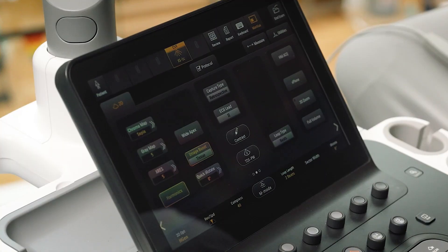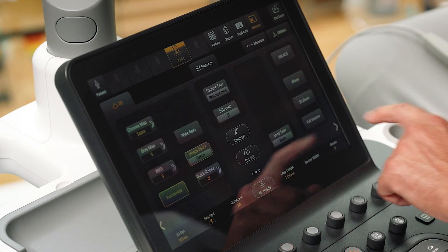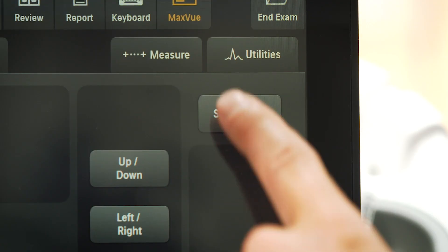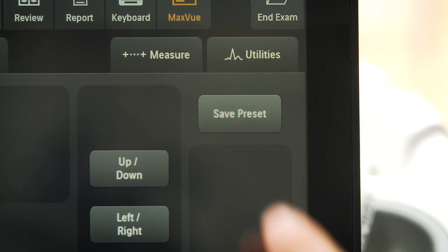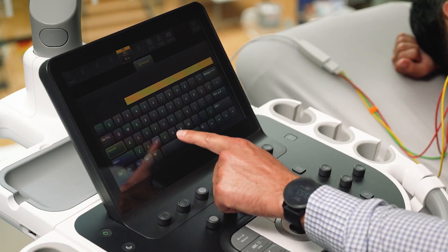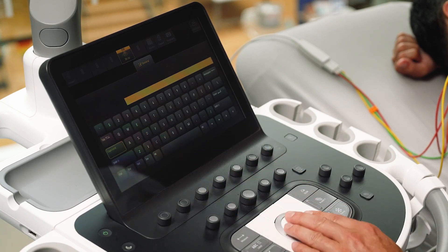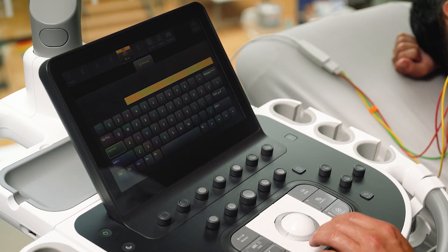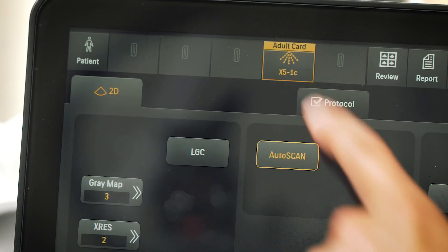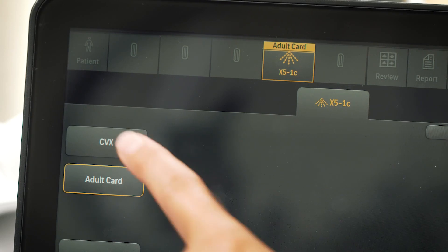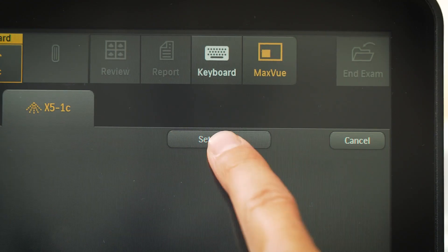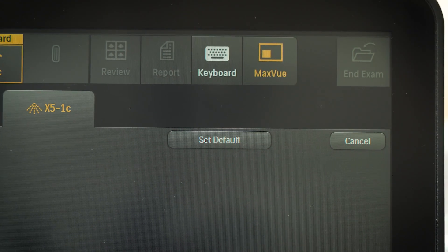It is possible to save your desired image settings. This is done using the save preset button. Give your preset a suitable name. This will be saved under the transducer tab. Your desired preset can also be set as default to help reduce scanning time.